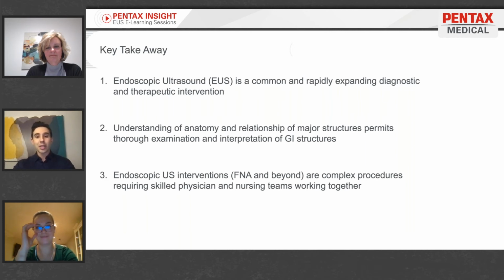I sit with my nurses and we talk about what we see in the structures, and it really becomes an educational day for all of us involved when we do these procedures. And with endoscopic ultrasound intervention, the FNA and beyond, we don't just biopsy cancers anymore. We treat gastric varices, we drain pancreatic cysts, we put stents into bile ducts using endoscopic ultrasound. So these are complex procedures, and they require the cooperation of skilled endoscopists and skilled endoscopy nurses. The close working together of these parties really ensures that we're going to be successful for our patients.